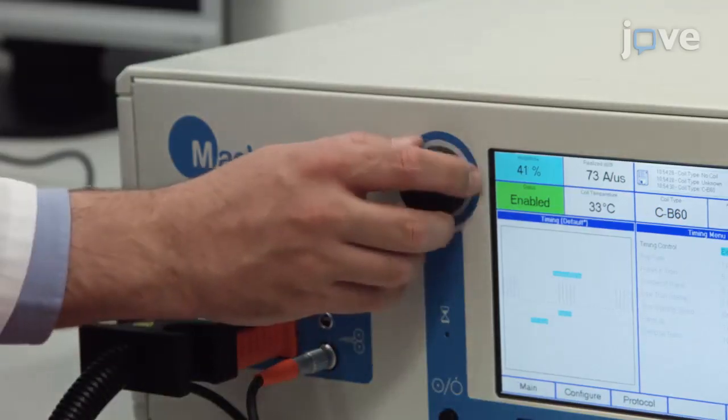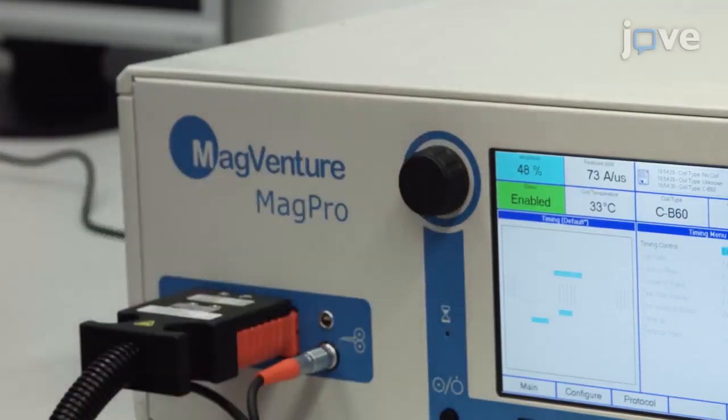We also use EEG-synchronized TMS to investigate the basic neurophysiology of brain oscillations in the human by comparing the effects that stimuli have, which are identical but are applied during different brain states. The effects can be subtle and are easily washed out by other sources of experimental variability. We found that low stimulus intensity works best to observe the effect of sensory motor rhythm on corticospinal excitability.